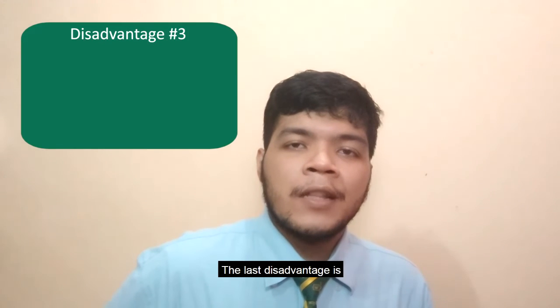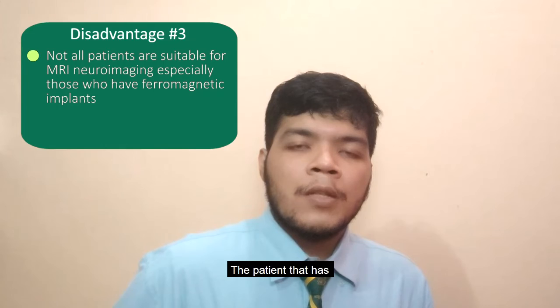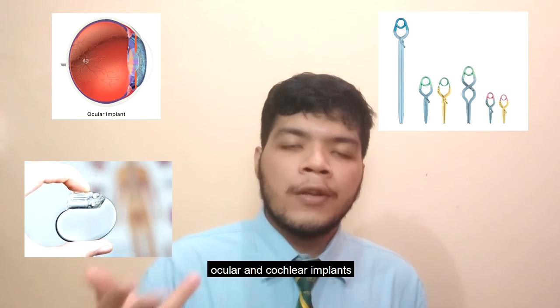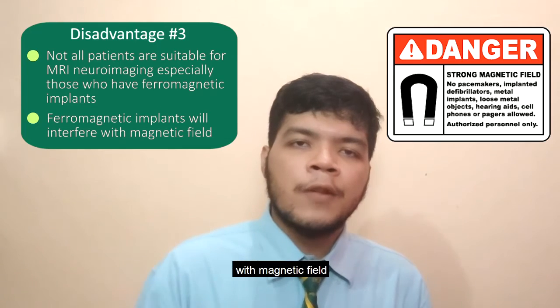The last disadvantage is not all patients are appropriate for this machine. Patients that have ferromagnetic material implants inside the body, such as pacemakers, aneurysm clips, ocular and cochlear implants are not suitable because it will interfere with the magnetic field.